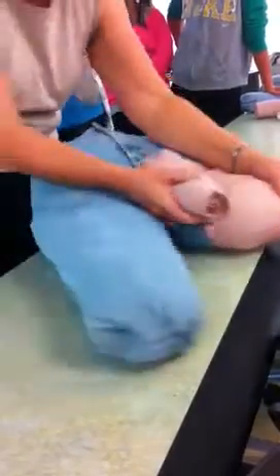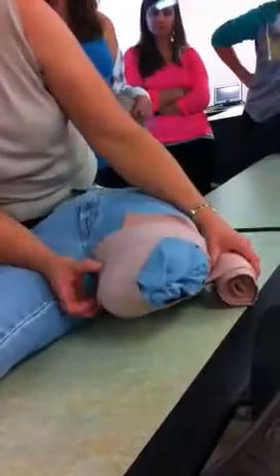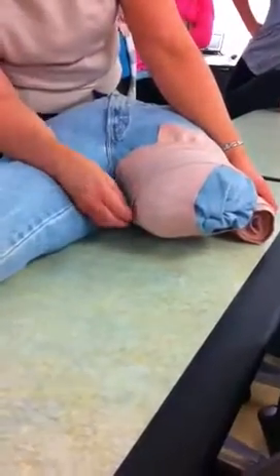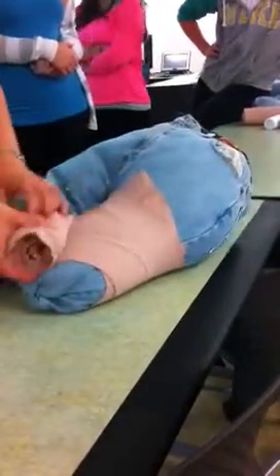But again, way in here. So you see where, if this was a real patient, I'd be kind of in the way of what's going on now. I don't like that. And sometimes you can just pull or place the bandage so that it's better. It's not the best. I'm not going to be really happy with this, but we'll aim.